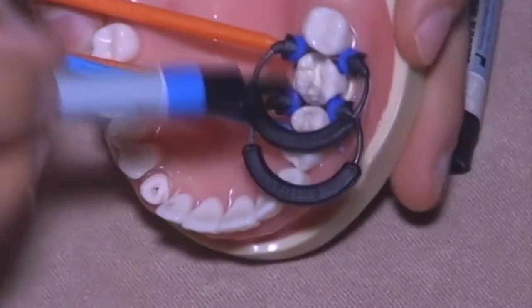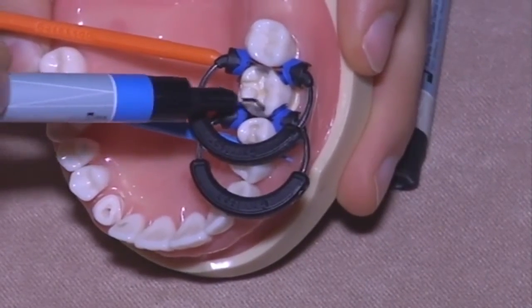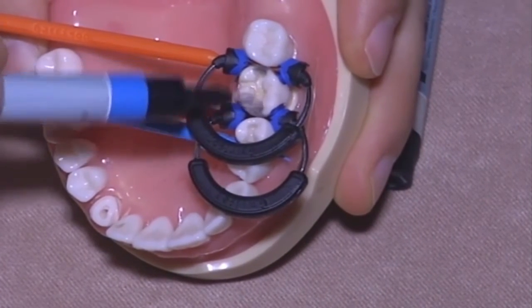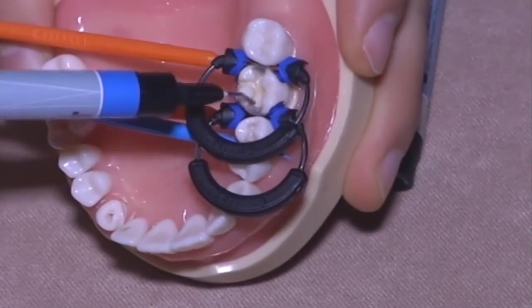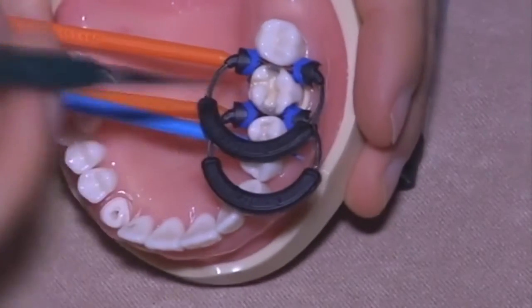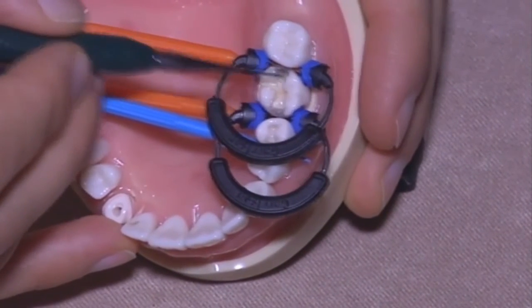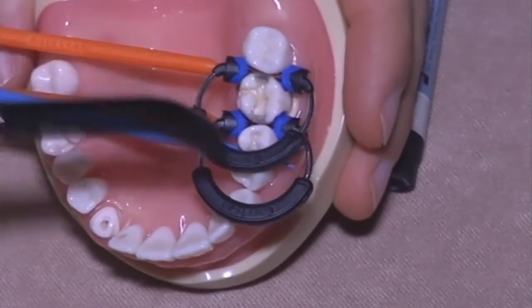Again, flowable composite along the wall of the cavity everywhere. A small quantity of flowable. Light cure.